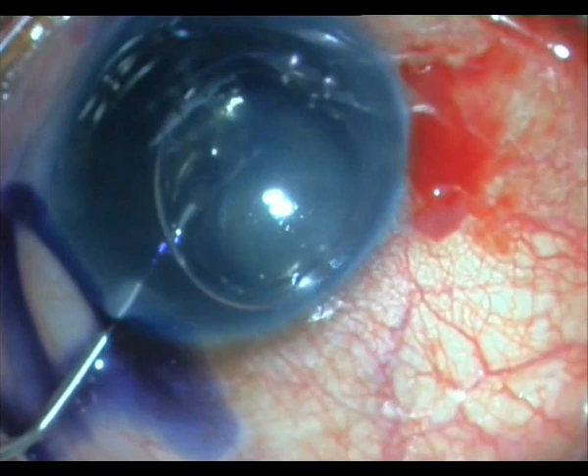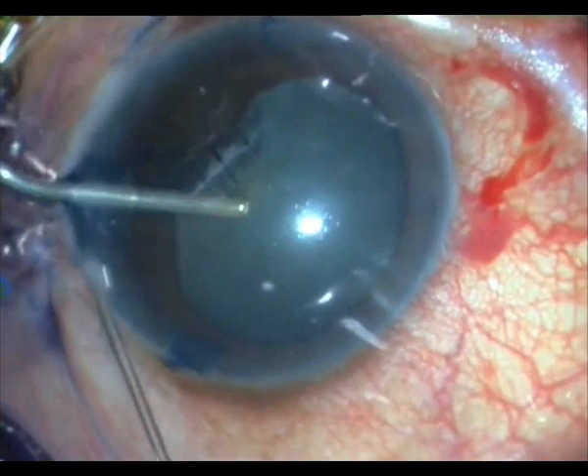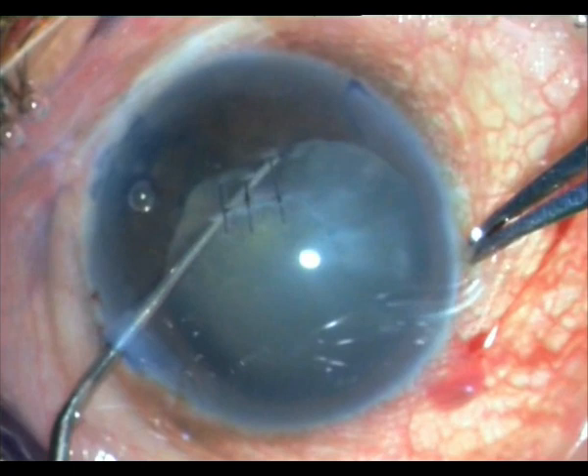I stain the anterior capsule with Trypan Blue, then expel all the Trypan Blue as well as the air bubble by placing 2% HPMC OVD within the anterior chamber. With the Sinski hook, I separate the few synechiae that are present. See how taut the fibrosis is — nothing happens, it doesn't extend.